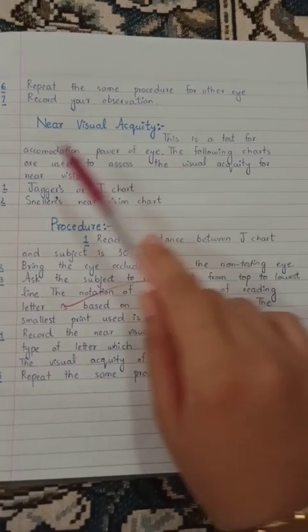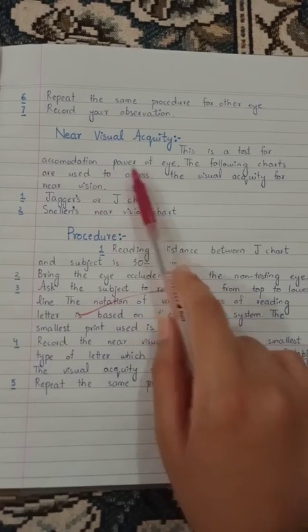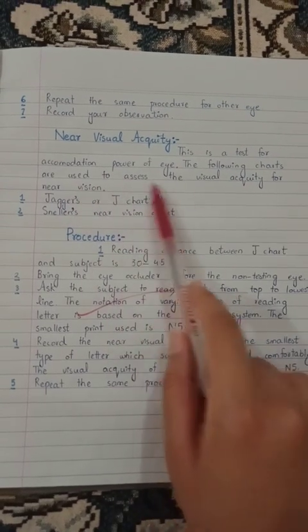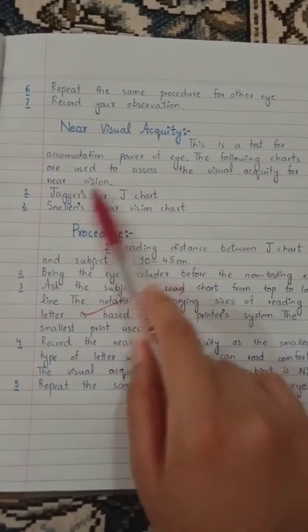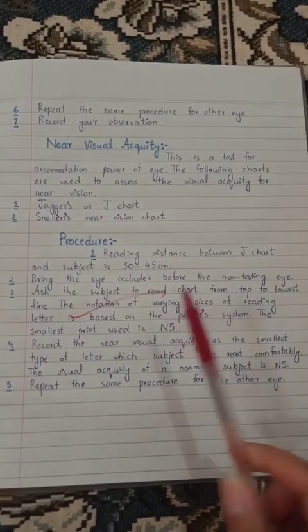Now we will discuss near visual acuity. This is the test for accommodation power of the eye. The following charts are used to assess the visual acuity for near vision: Jaeger's or J chart and Snellen's near vision chart. Now we will discuss its procedure in the next lecture.